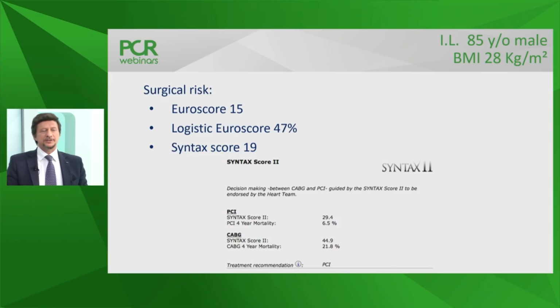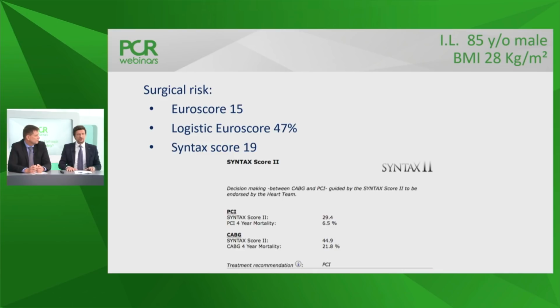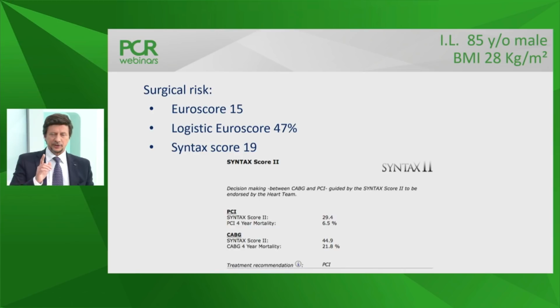This is a situation in which surgery and PCI can be discussed, and this is the situation in which scores and discussion in the heart team are essential. And this is what we did, because my first temptation was to call the surgeon. You cannot see that from the image because you see a guide catheter already, but he had a diagnostic angiogram, and he was advised to talk to the referring physician to convince him to undergo surgery.